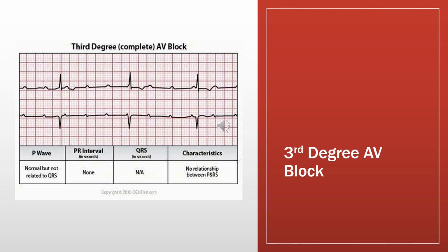A lot of the times, the second degree heart block is something I will tell a veterinarian about, and if it's not happening all the time, they won't get overly excited about it, especially if we have given them dexmedetomidine.